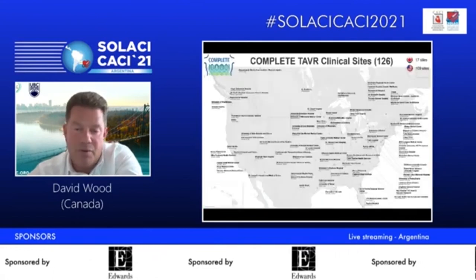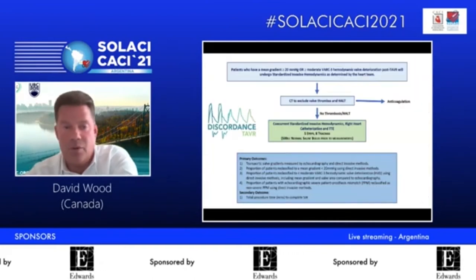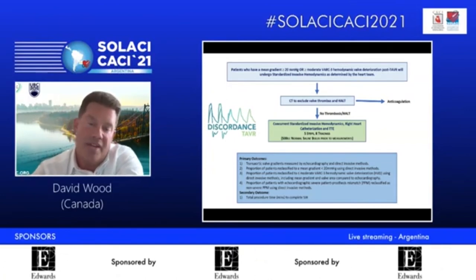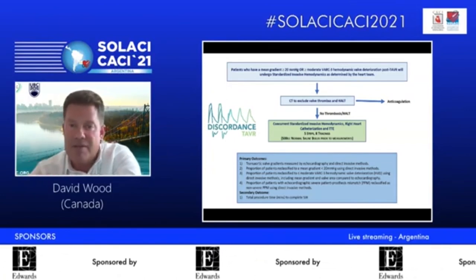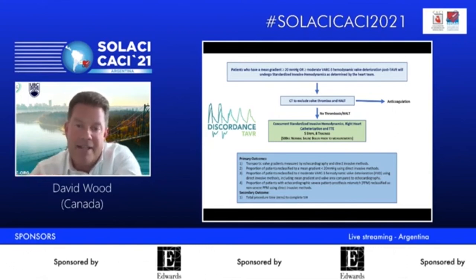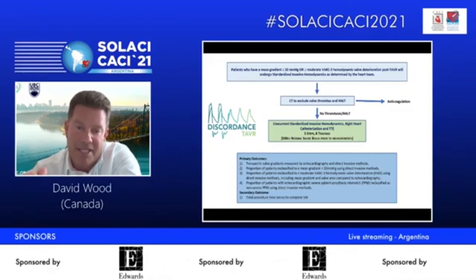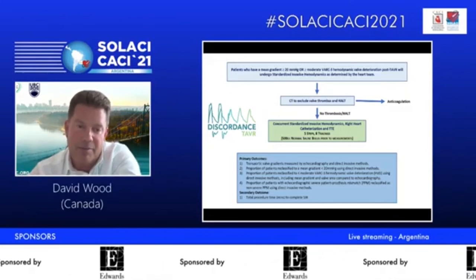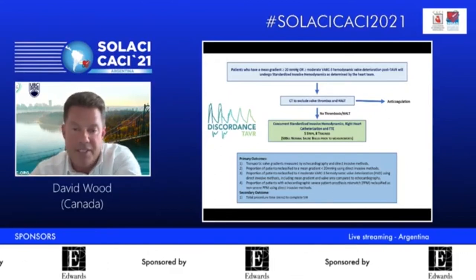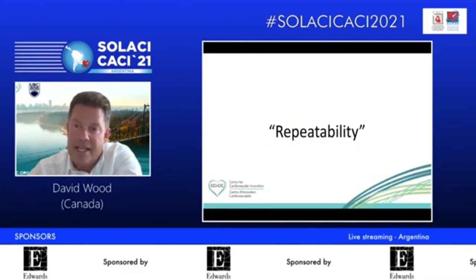And then Discordance TAVR, I don't have the map, but there's 11 sites we've enrolled. I believe it's 22 or 26 of the 50. We're trying to get it fully enrolled. And this is any patient who's had TAVR in the last 10 years with an echo gradient over 20 or meets VARC-3 criteria for hemodynamic valve deterioration, coming back after a CT to exclude valve thrombosis and a full hemodynamic on-table echo. And I think this will be incredibly provocative on top of the pilot study that hopefully will come out in Circ Intervention in the next couple of months.